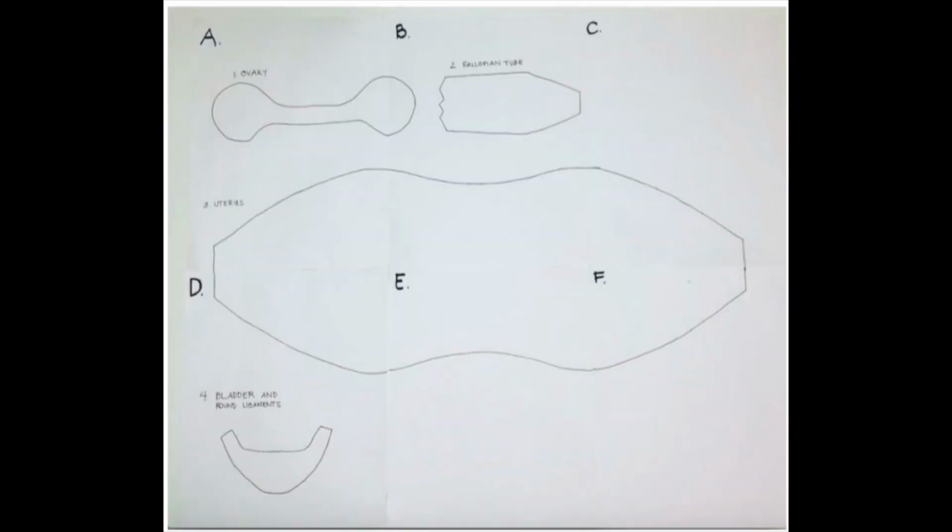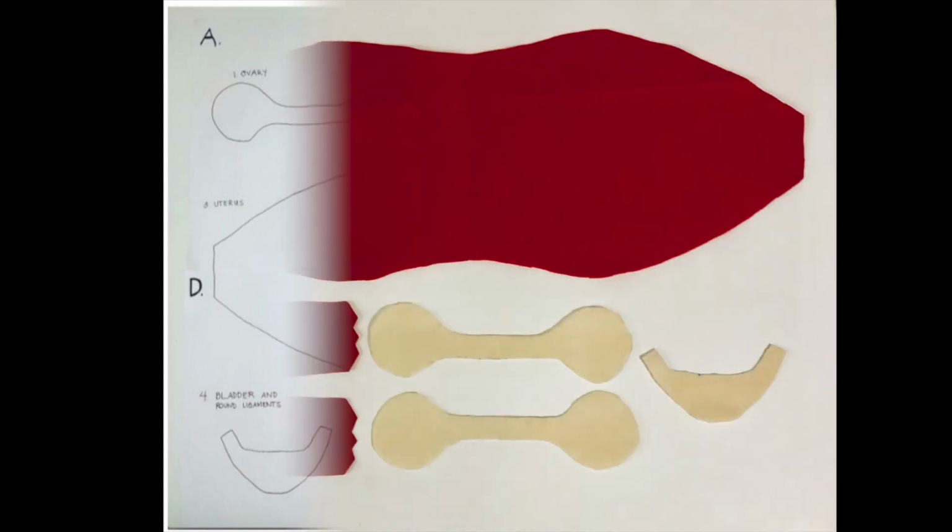Print the provided stencils to use as a guide. Arrange each page of the stencil from A through F as shown here. Tape the pieces of paper together and cut out the shapes. Use the stencils to trace out shapes onto felt fabric.